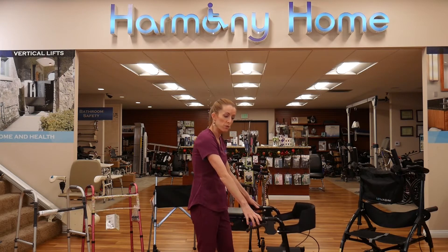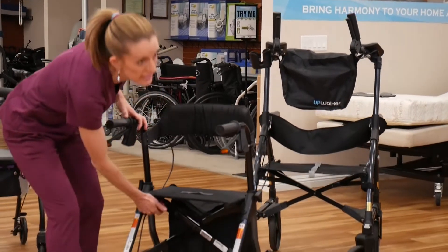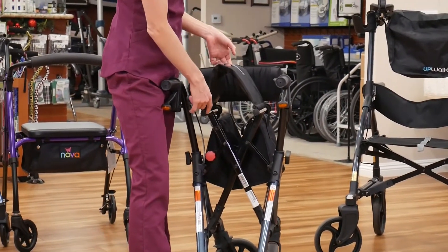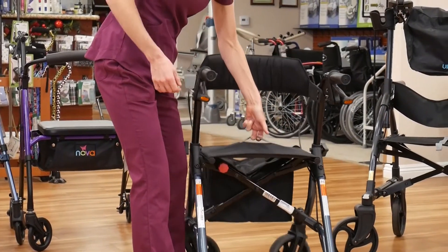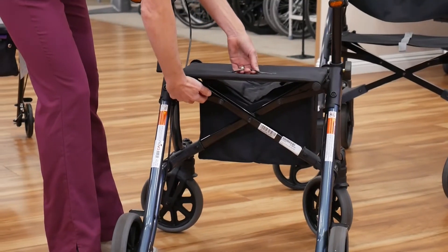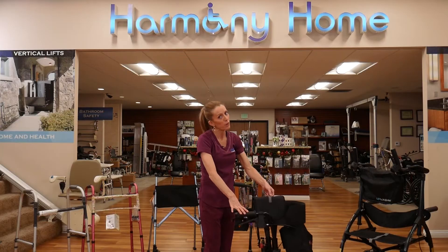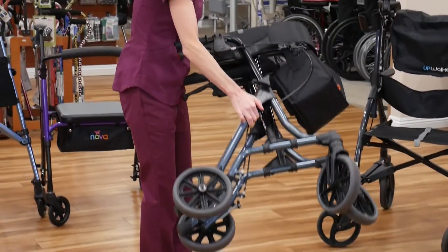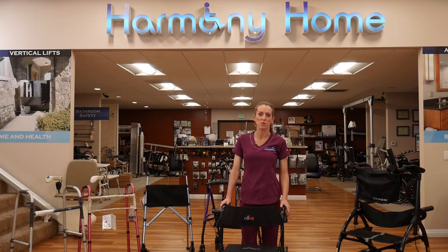For folding, the Nova Forte is a unique product because it has a release down here. There's a red button to pull and then pull the seat up. Once that release is triggered, it's very easy to pull up. Before it is triggered, it won't go — and that's so it keeps its rigidity when you're using it, so it can be nice and stable. Just release and pull. The rollator stays folded and doesn't unfold, which makes it really easy to handle in and out of the car. That covers the Nova Forte rollator.